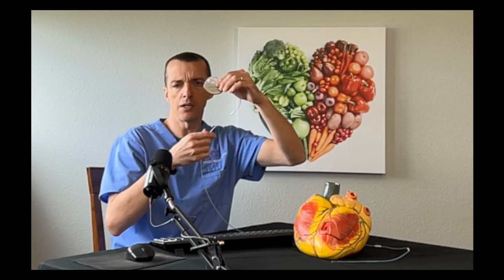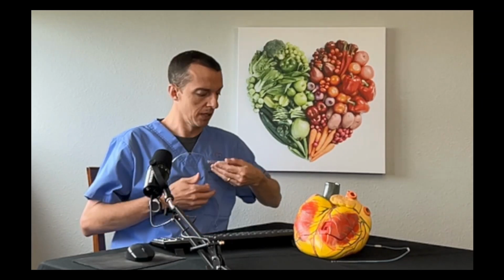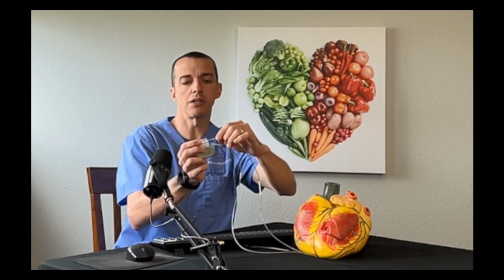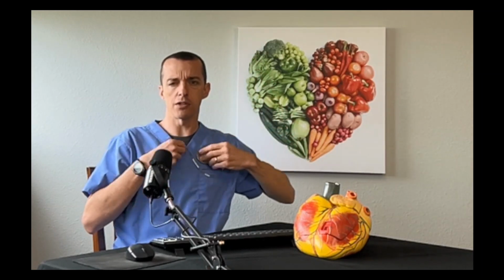It inserts in there, and then this whole thing is tucked down and dropped down into what that chest x-ray was showing, into the right atrium. Again, you might have a second wire, so you could have two wires plugged in. You could even have three wires. And so you could have multiple wires stuffed down into the pocket and then down into the chest. Okay, so just kind of envision that.